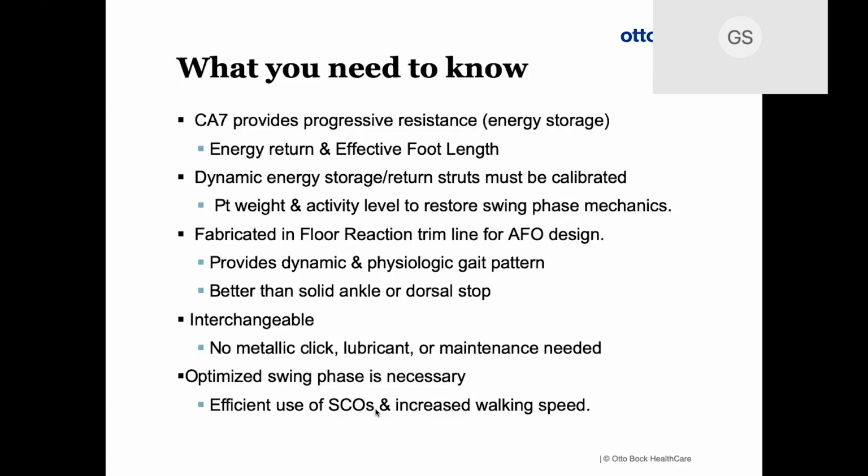Now here's the tough part, though, and we'll talk a little bit about this. We don't quite know how much energy return you're going to get in terms of plantar flexion. So you have to kind of determine that. So for any sort of carbon member to release energy, it has to be deflected first. So how much deflection is necessary? And the thing is, it's not really adjustable. So you have to have a feel or develop an anecdotal, qualitative, phenomenological understanding of how posterior leaf spring devices work and how this particular one works.